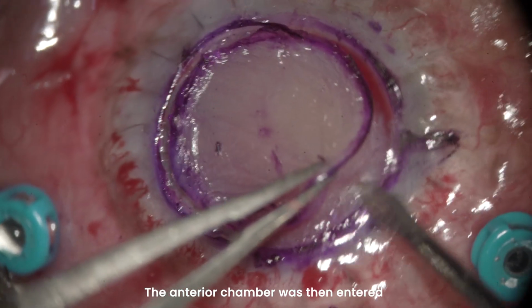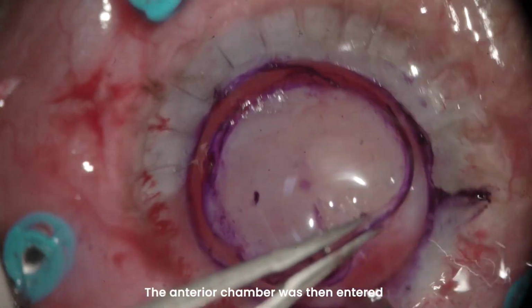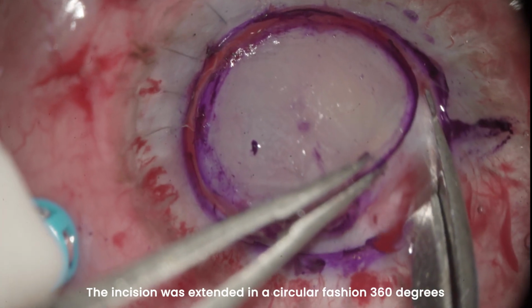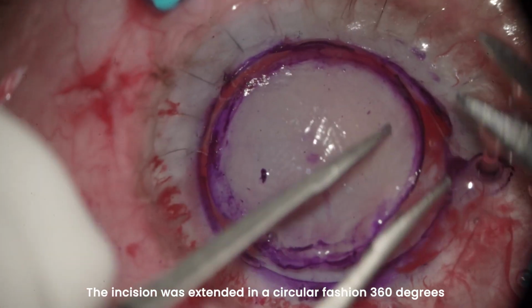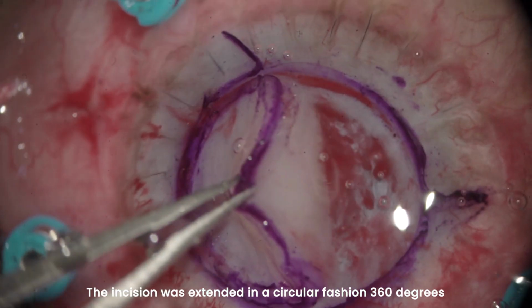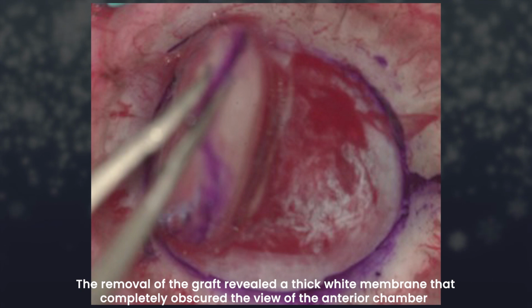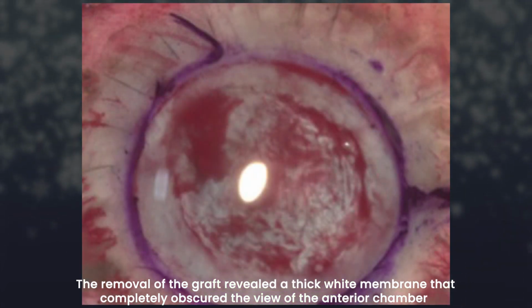The anterior chamber was then entered. The incision was extended in a circular fashion 360 degrees. The removal of the graft revealed a thick white membrane that completely obscured the view of the anterior chamber.